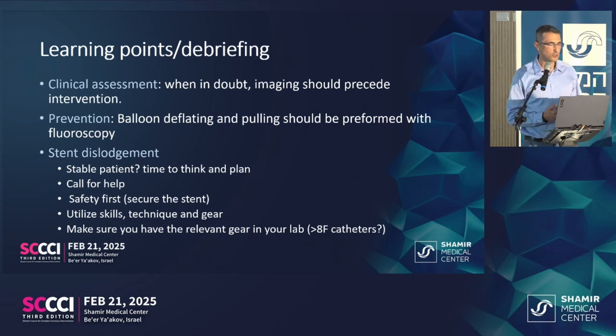Second thing is prevention. Balloon deflating and pulling should be performed with fluoroscopy. So if I debrief myself, after post-dilatation, I'm not sure I saw the balloon going all the way out, so I didn't do that on fluoro. If I were to debrief something, that was my mistake. You've just post-dilated the stent, make sure that you see that when you pull out the balloon, it gets pulled without pulling the stent out. So that was my main debriefing point.